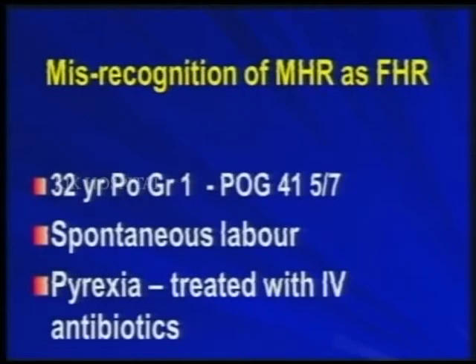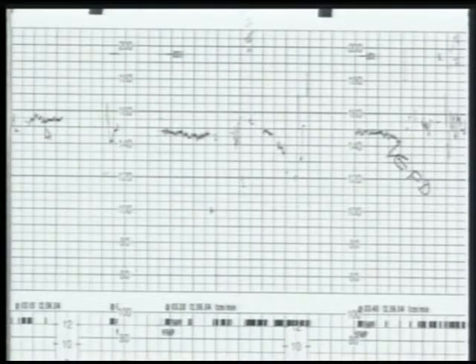Now, another problem with the fetal heart rate is: is it normal or not? We have to think about the physiology, and this is a misrecognition of the maternal heart rate. She is 41 weeks and 5 days, and you can see the heart rate is not properly recorded.